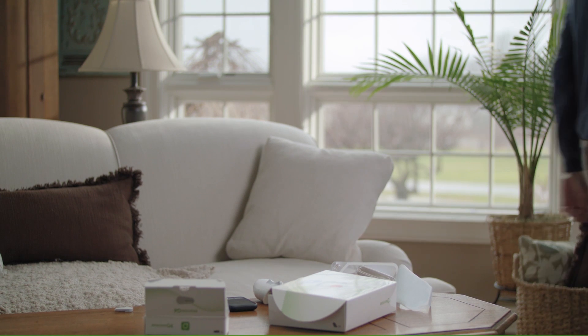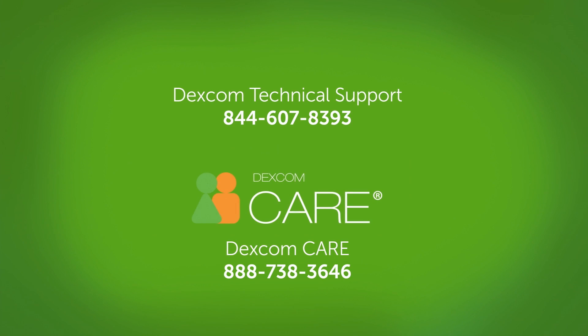That's it. Now you know how to replace your Dexcom G6 transmitter. Of course, if you have any questions during setup or any other time, call Dexcom Technical Support or Dexcom Care.